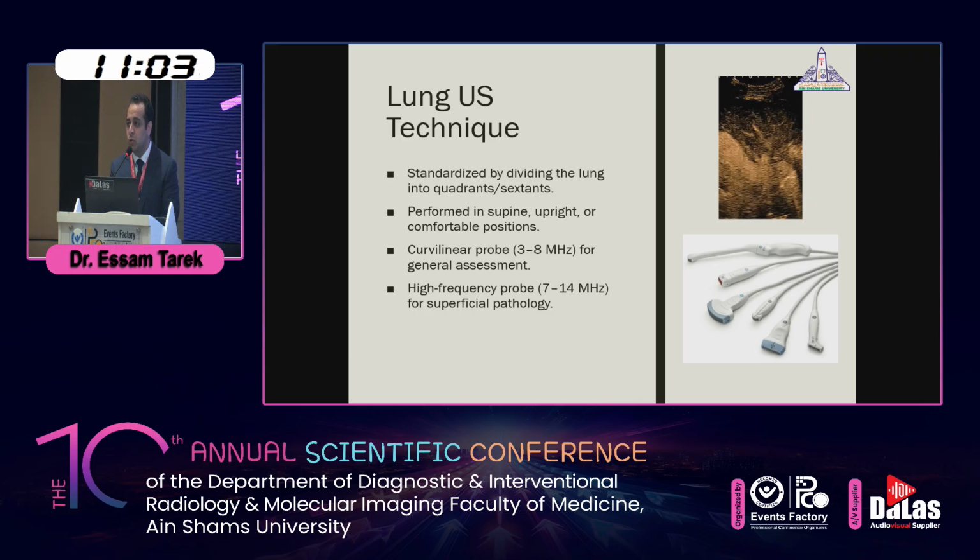Most of the time we use the curvilinear probe for more anatomical detail, while we can go for the linear transducer, which is more superficial, for more specific detail.